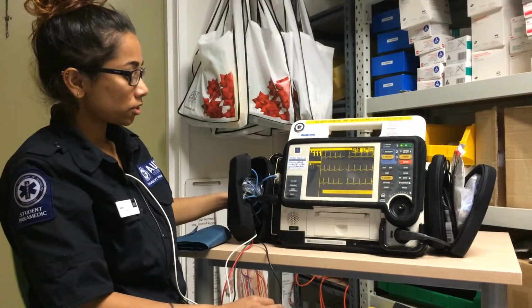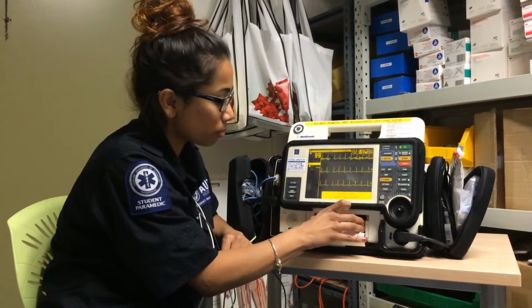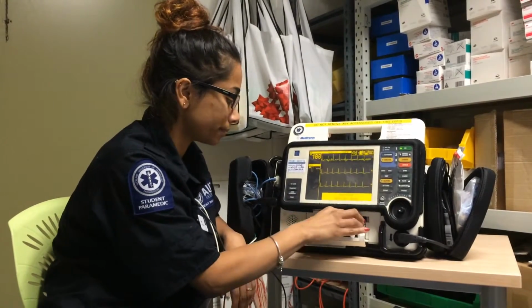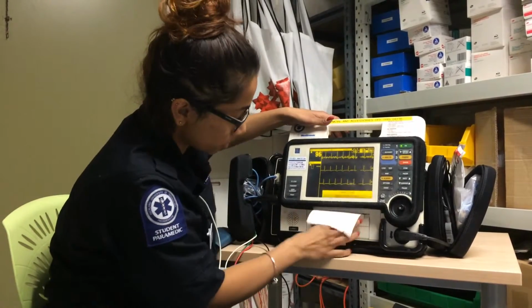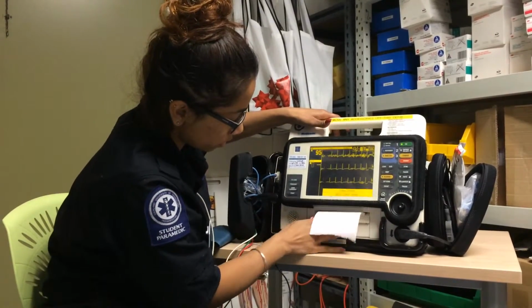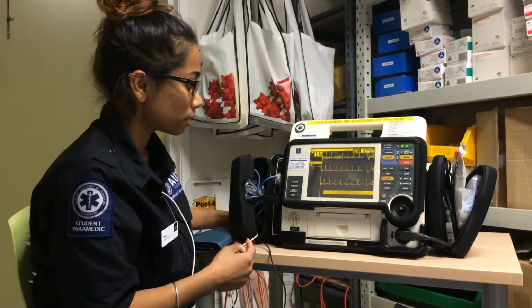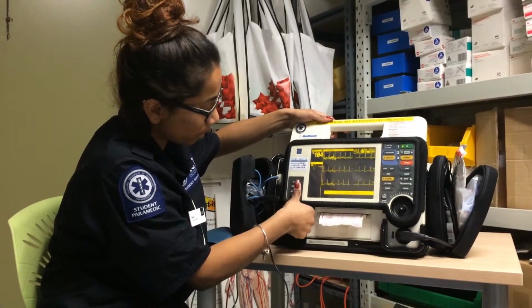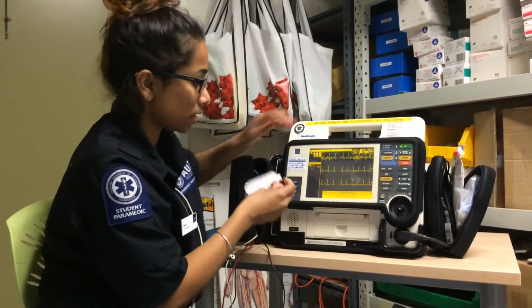And if you want to change it, all you need to do is pull out the paper like so, pull out your empty roll, put in a new roll, and you want to then close the port like so. And you want to check that it is in properly, so you want to click print, and it will print out some paper, and then you know that it is actually in there.